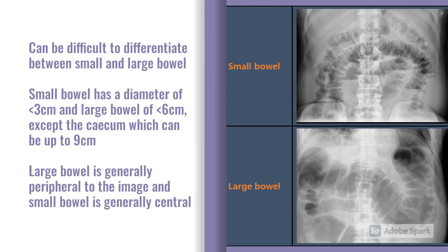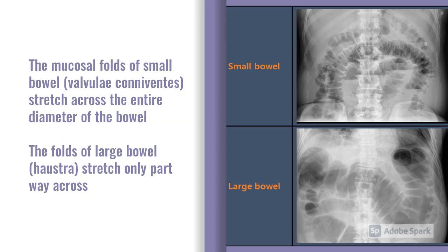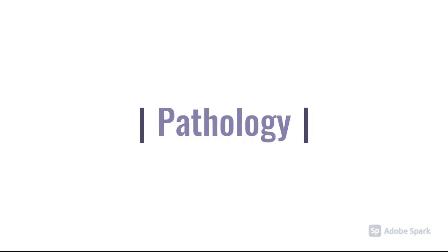It's often difficult to differentiate large and small bowel on abdominal x-rays, but there are a couple of clues. One of the key things is size: small bowel tends to be up to about three centimetres, large bowel up to about six, except for the caecal area which can be up to nine centimetres. So three, six, nine are the numbers to have in mind. We'd expect large bowel to be generally peripheral and small bowel more central, though patients may have abnormal anatomy. We also use the mucosal folds — the mucosal fold of small bowel stretches across the entire diameter, whereas the haustra of the large bowel only go part way across.